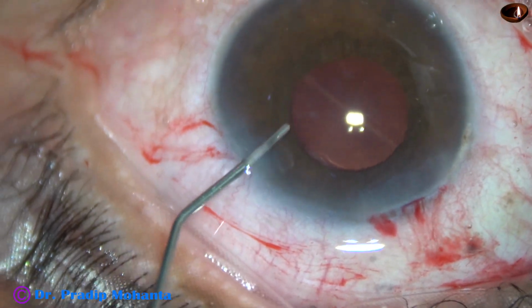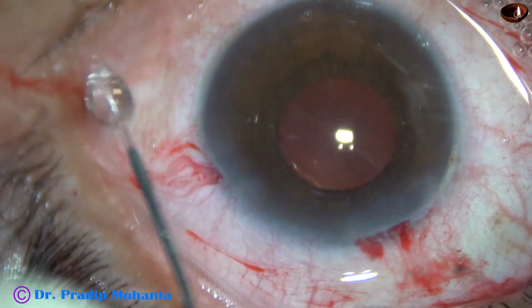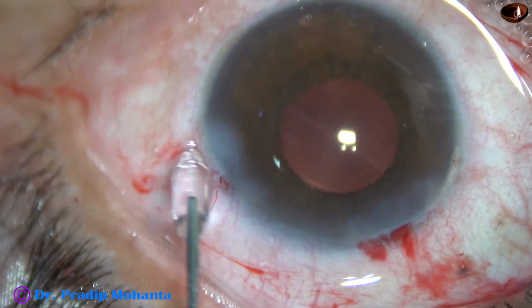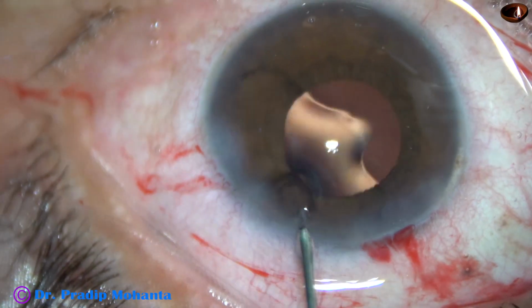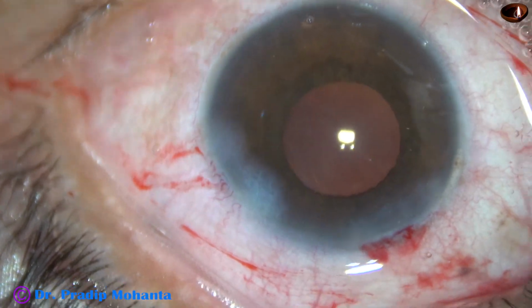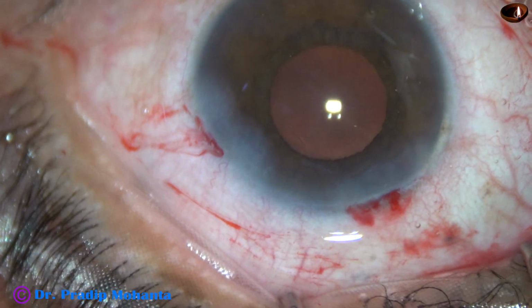This is a bit of moxifloxacin. And now the corneal stroma on either side of the side port is hydrated so that these paracentesis wounds get closed. Now we are towards the end of the surgery.